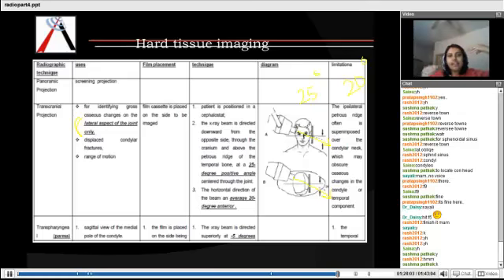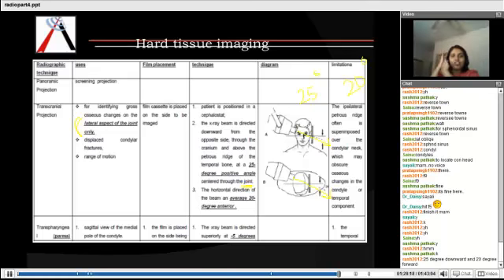We want the X-ray to go above the petrous ridge, and it should pass through the joint. This side joint is to be imaged, right? Yes, it's 25 degrees downward and 20 degrees forward, above the petrous ridge, through the condyle of the side we want to image.